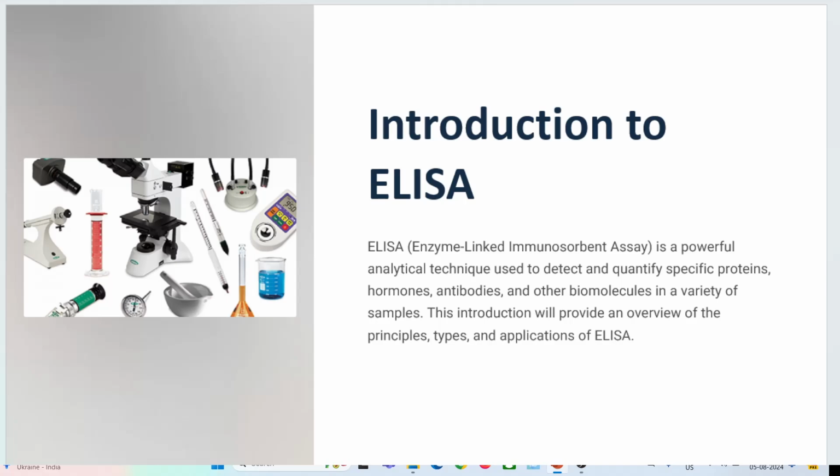We are going to speak about the ELISA, that is enzyme-linked immunosorbent assay. This is a very basic diagnostic technique used to find viral diseases, that is HIV, herpes, and many more. What exactly the ELISA does is, here we have antigen and antibody interaction.